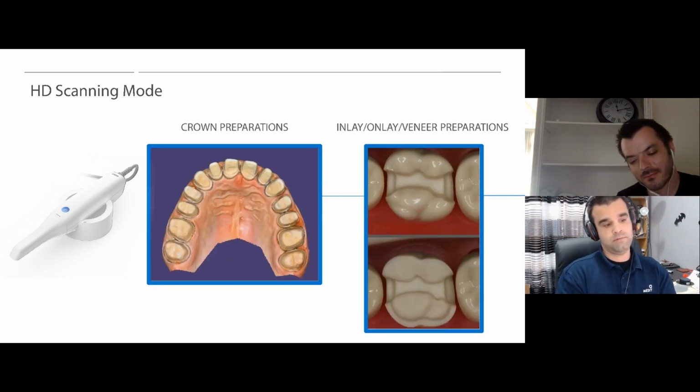Crown preparations, it's standard. I think everybody can notice that and can think about that. And of course, everything that requires a margin line, like inlays, onlays, veneers, etc. For all of them, I highly recommend all of you to use HD mode.